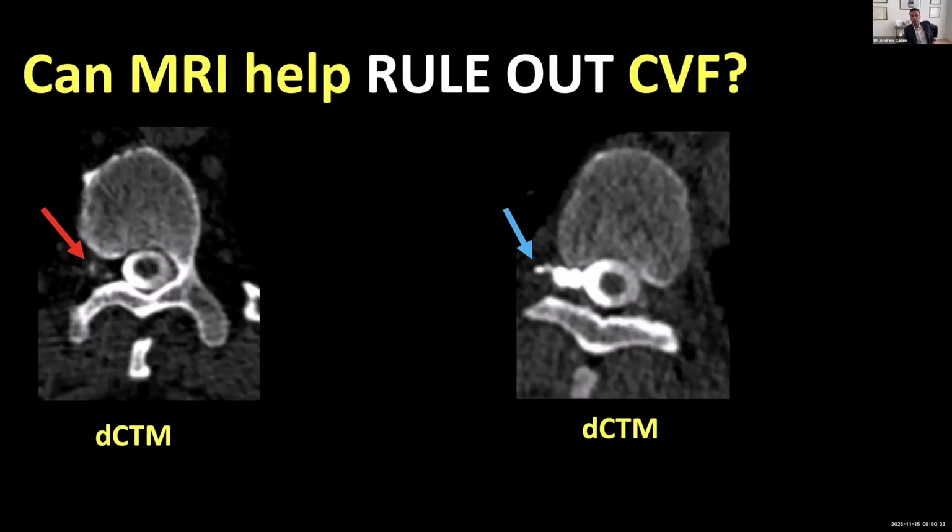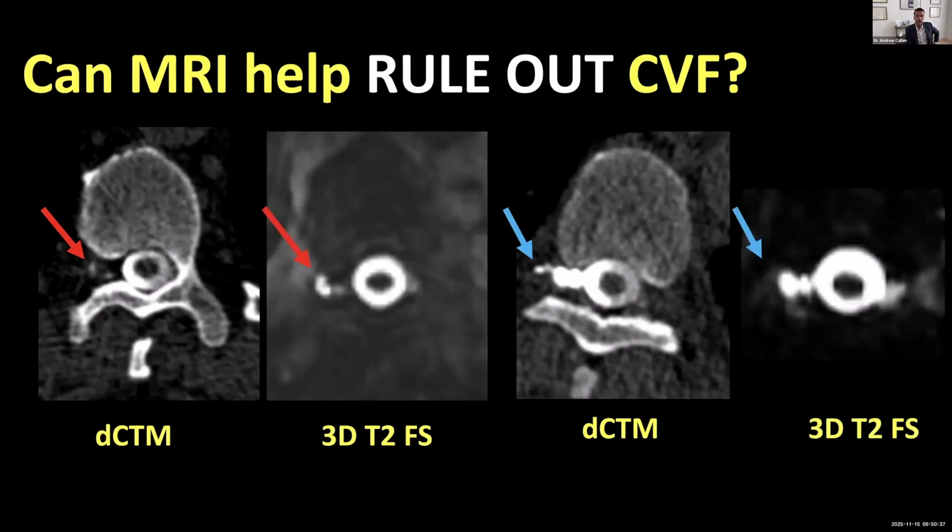First, I like to have the myelogram up next to and side by side with the MRI of the spine with that T2 fat suppressed imaging, usually 3D, but as long as there's some sort of axial T2 fat suppressed imaging available, then I can sort of troubleshoot these foraminal densities. In this patient here, I see a little bit of high density here layering out here, and I'm wondering, oh, could that potentially be a CSF venous fistula?